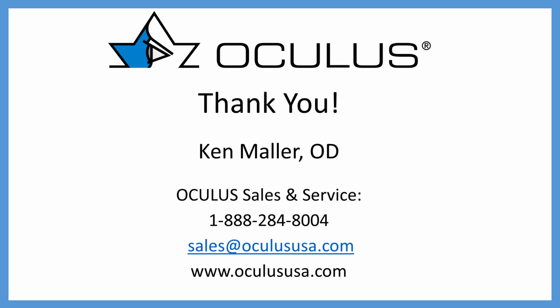And so I can say unequivocally that over the couple of years now that I've been using the CSP software, my mindset has changed dramatically: it doesn't matter what's going on with the cornea. You have to measure the sclera on its own merits, and do not be surprised at the degree of asymmetry that can be there. Clearly that's coming from the insertion of the recti muscles, as well as possibly some other influences, as to why you end up with so much asymmetry on these scleral surfaces.